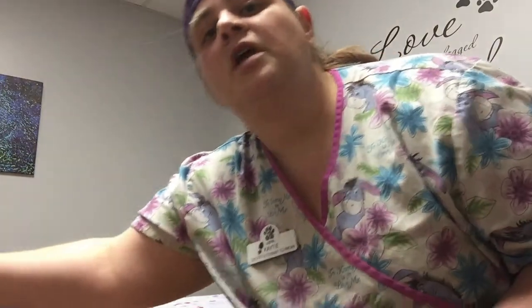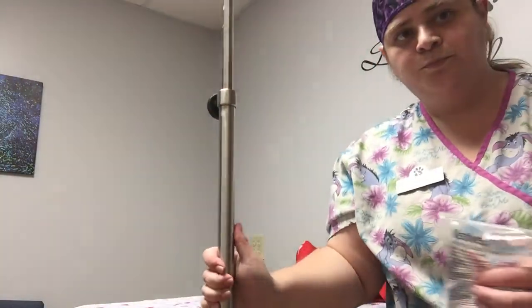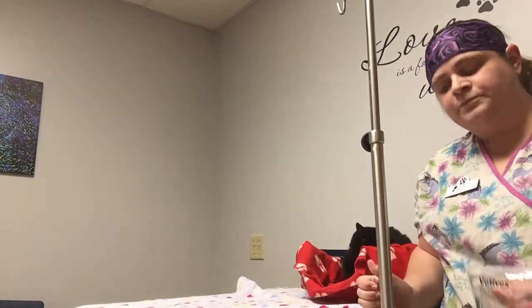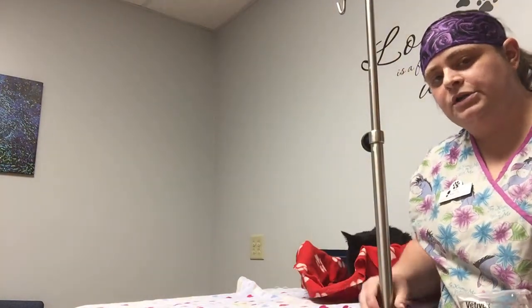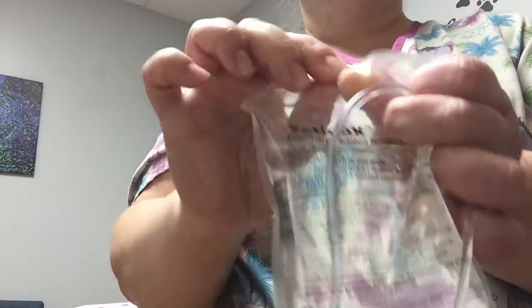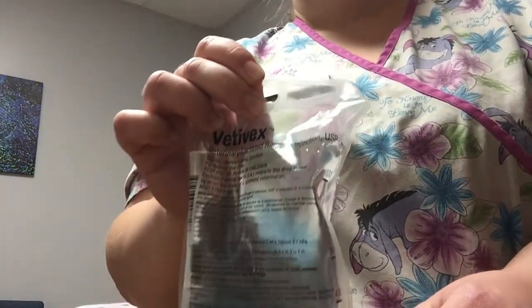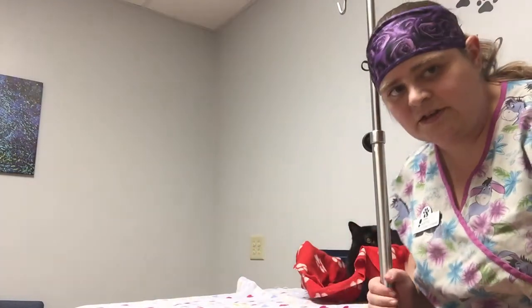I realize most people don't have IV poles in their living rooms, but that's what we're using today. In lieu of an IV pole, you could use a coat hanger, a hook on the back of a door, or anything that can go through this hook hole right here — anything where gravity is going to help.